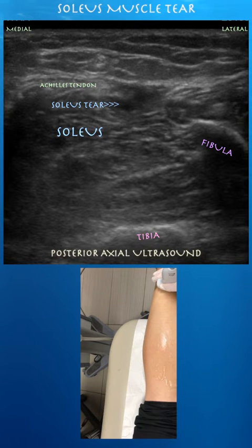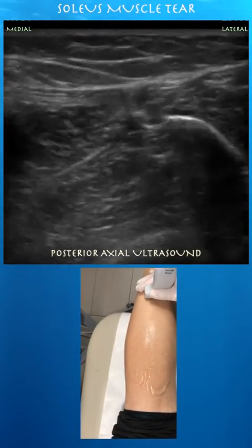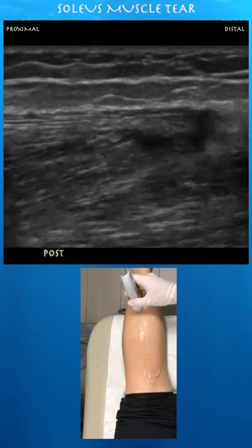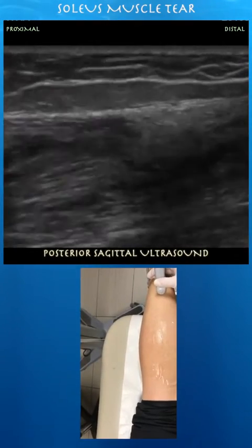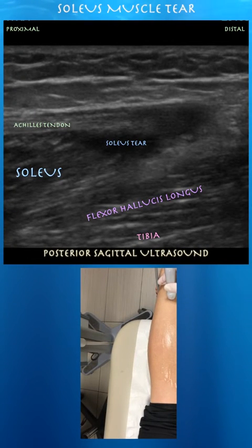Again looking at the Achilles tendon in cross-section — a dark signal around that distal Achilles tendon, so kind of right in here. You can see this anechoic signal around the distal Achilles tendon.